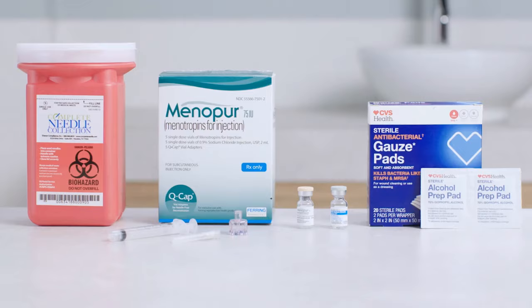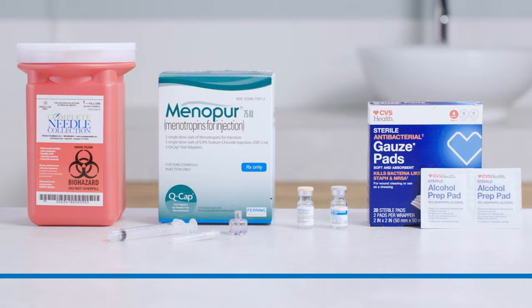Let's start by making sure you've got all your supplies ready to go. Depending on your dose, a vial or more of Menopur — each vial should contain powder or a pellet — a vial of sterile diluent, a syringe, a Q-Cap for mixing, an injection needle, plus alcohol pads, a gauze pad or cotton square, a sharps container, and a clean surface.